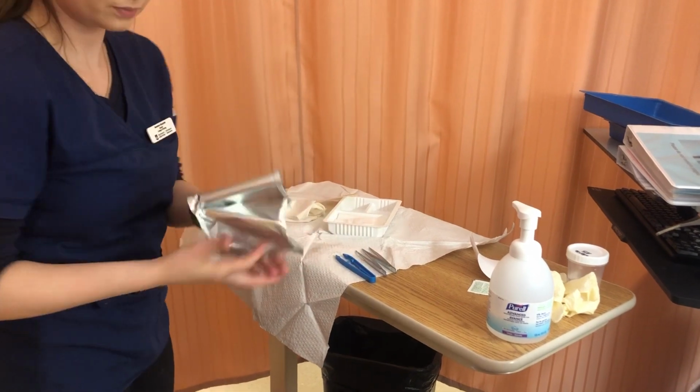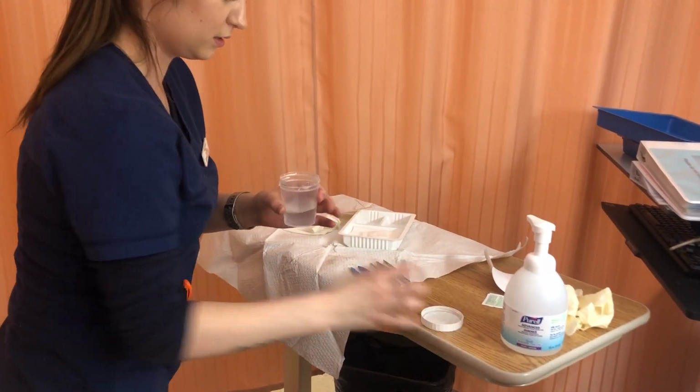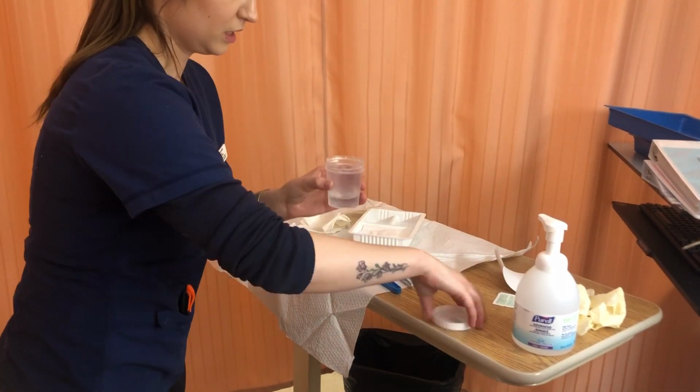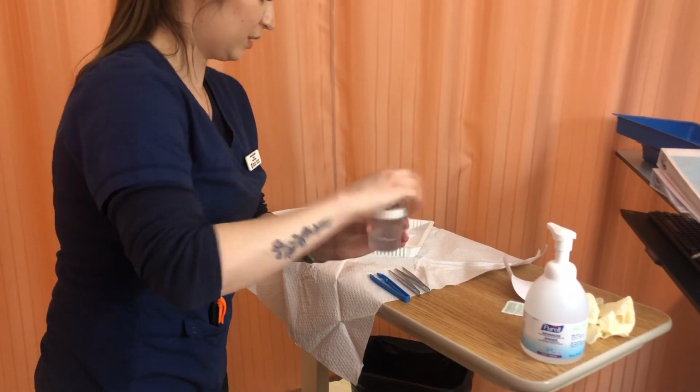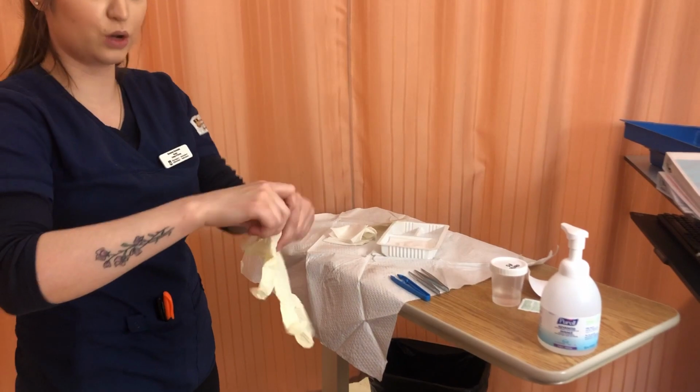Place that there. And then just some sterile normal saline. So pour it, being careful not to splash. Okay, so now that my sterile field's set up, I'm going to put on gloves and remove the old dressing.